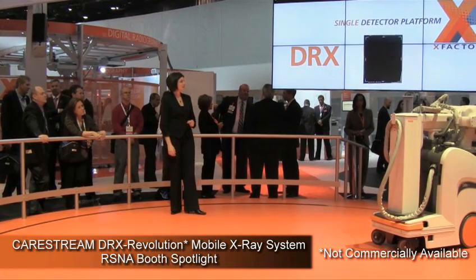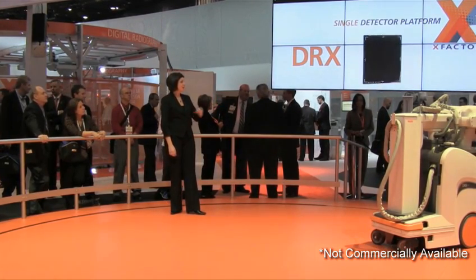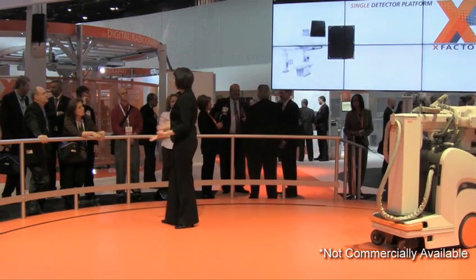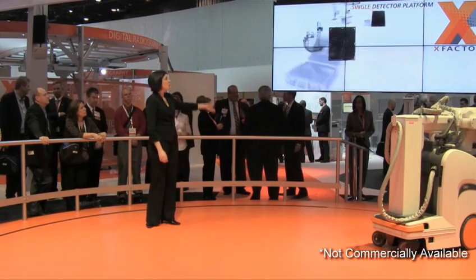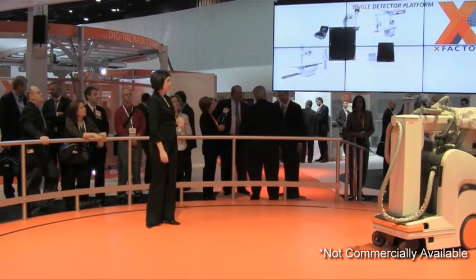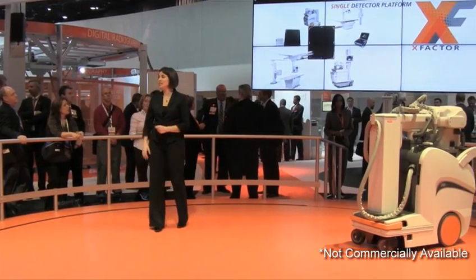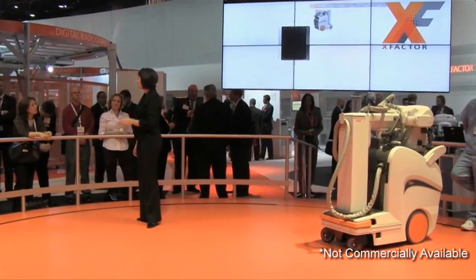The second generation DRX is here. It's lighter, easier to use, even more robust, and reduces preview times to speed workflow. The new DRX detector works across the entire DRX portfolio, moving seamlessly throughout your facility, maximizing your efficiency and providing unprecedented imaging flexibility.